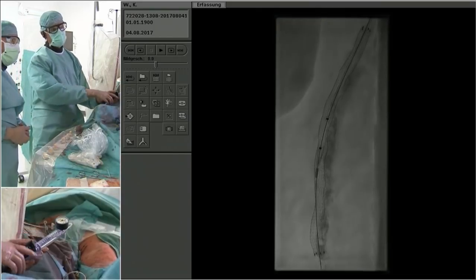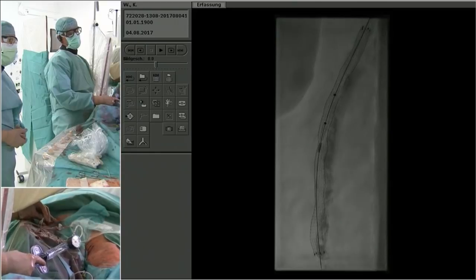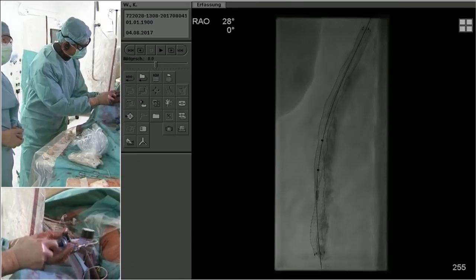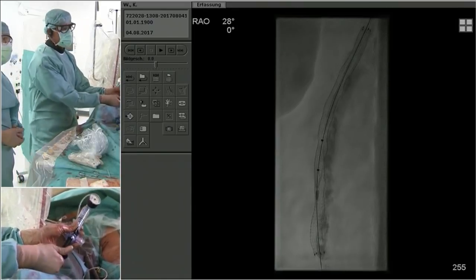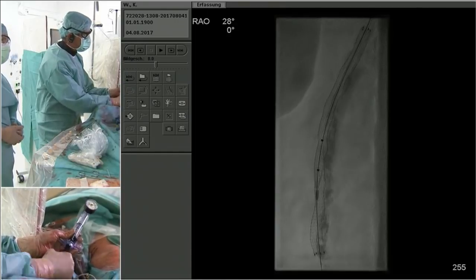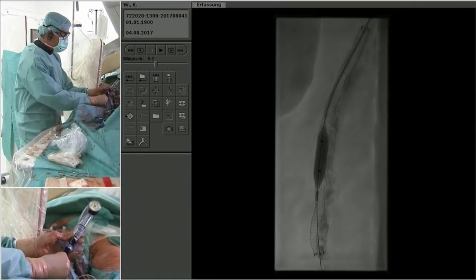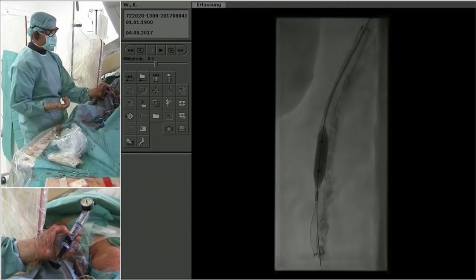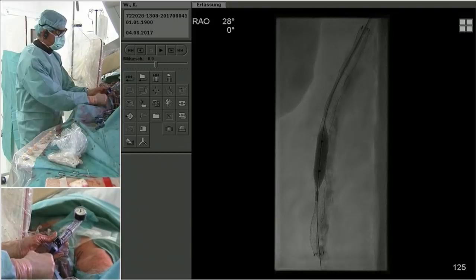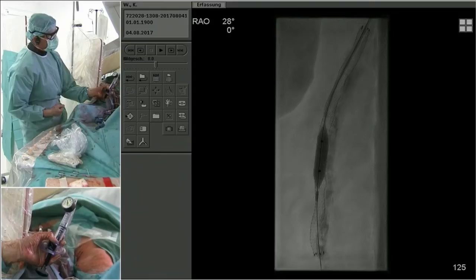Can I ask about the failure mode of the Viabahn, which is an edge, not in stent, and what is the recoil that he would accept not to increase the radial force? Andrej, did you hear the question? Christian? Yes, and I do not really have a clear answer, but in many cases we see some kind of spiral dissection, residual stenosis due to spiral dissection up to maybe 30%. That would actually be my cutoff. And this clearly is not the case here, I would say.